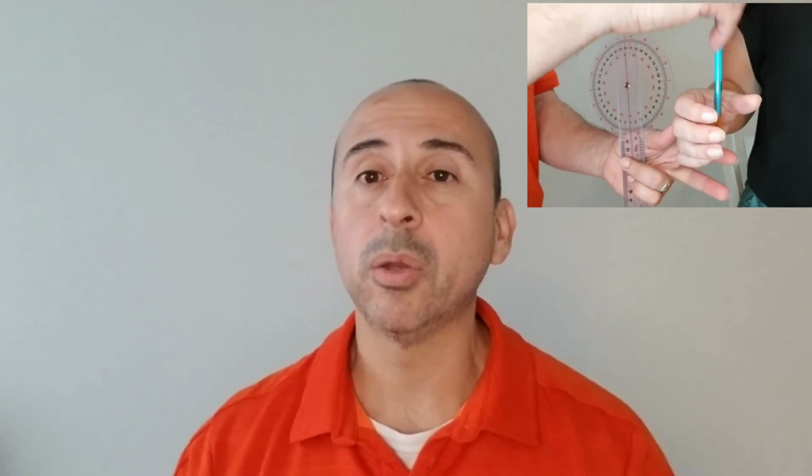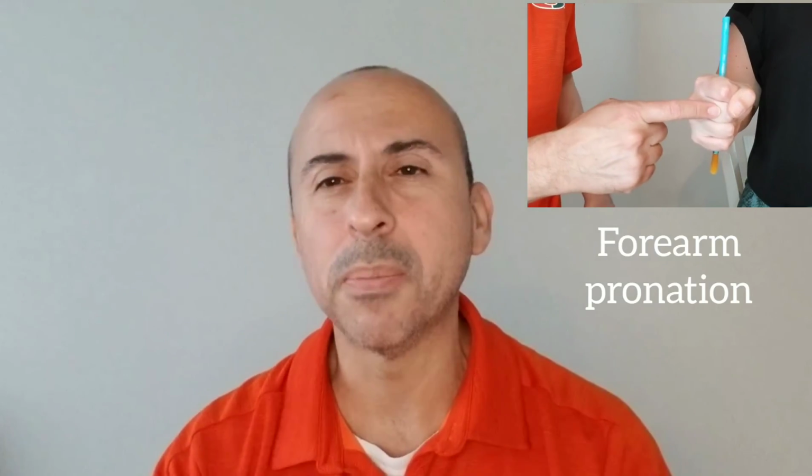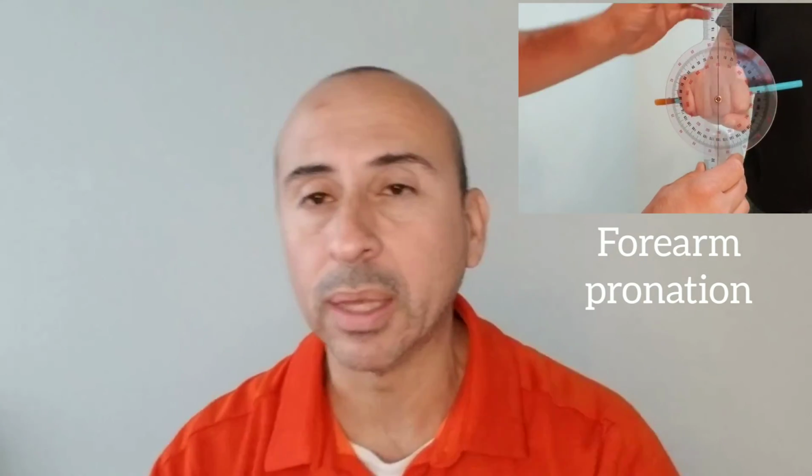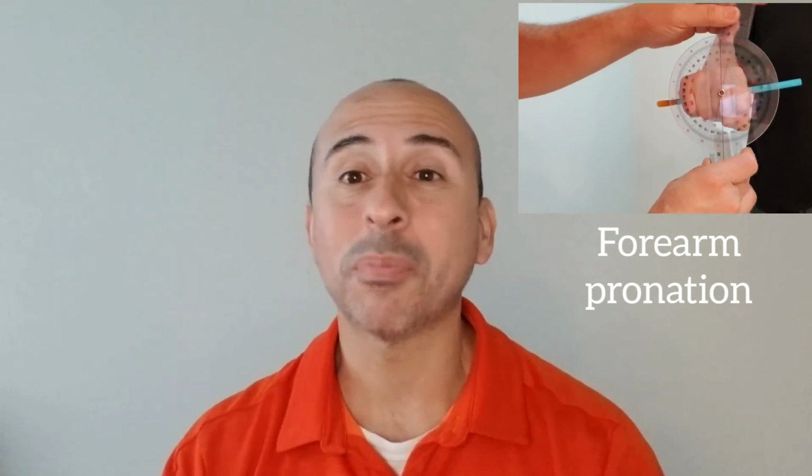And then what happens is you don't get the little variables that you would get with the client, in the sense that the client, they know you're testing them, but they don't know what you're testing exactly or how that's done. So they're not helping you, or sometimes their body, there's injuries, there's limitations, there's position issues, or even strength issues that people don't take into account. So keep in mind that when you're dealing with a real patient, positioning them, making sure that they're not going to lose their trunk control while you're doing it, or maybe laying them down on a mat so that you don't have to worry about that, or understanding that their strength might not be all there.